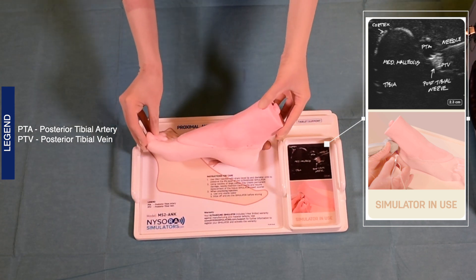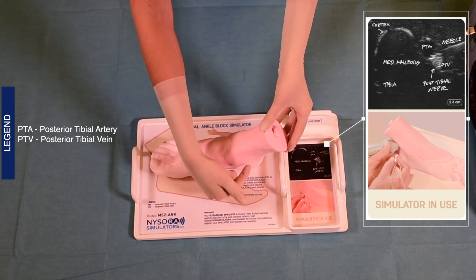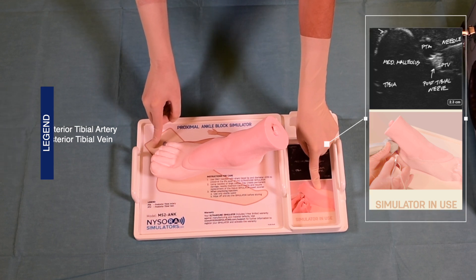Here we can see the line that connects the medial with the lateral malleolus where the injections occur. The left finger points to the suggested placement of the ultrasound transducer in order to accomplish the deep peroneal nerve block.